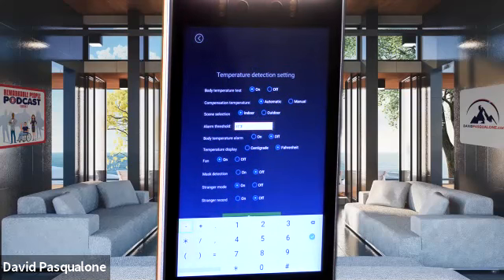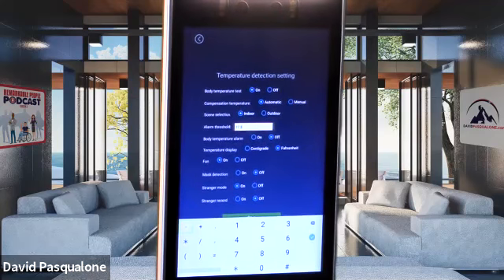So let's say I want to allow somebody in our building with a 100-degree temperature, but I don't want them to be 101. Really, you don't want 100 either, right? So 99 is okay, 101's not. This is where you type in your alarm threshold, like when it would signal red up top and when it would say access denied.